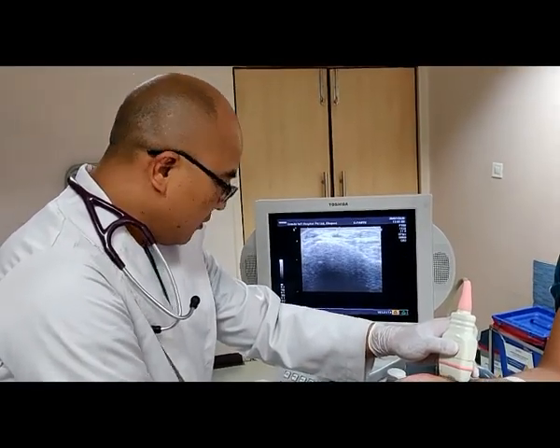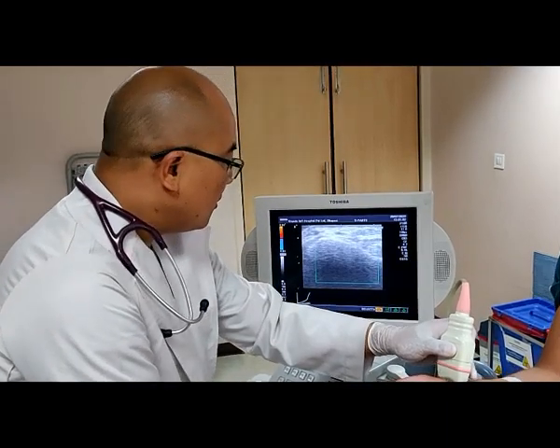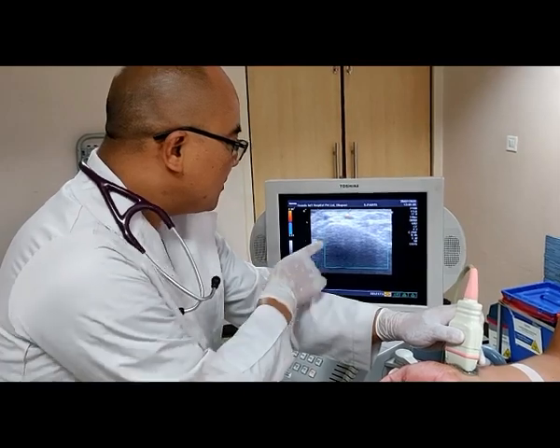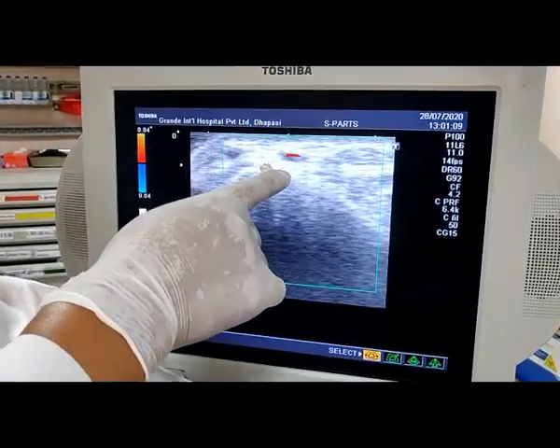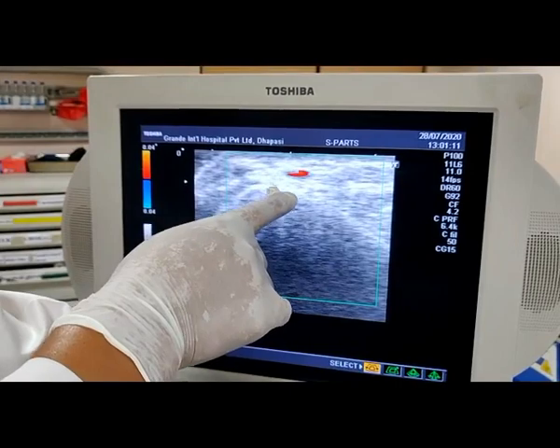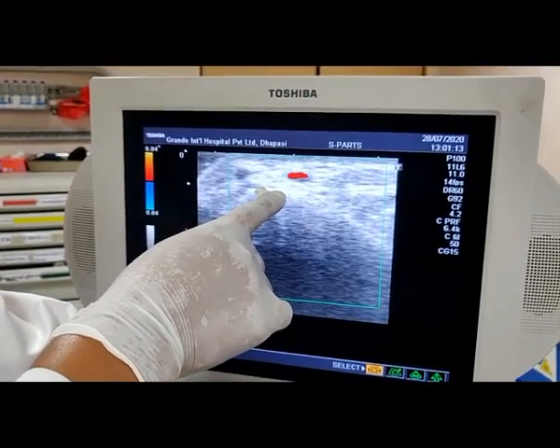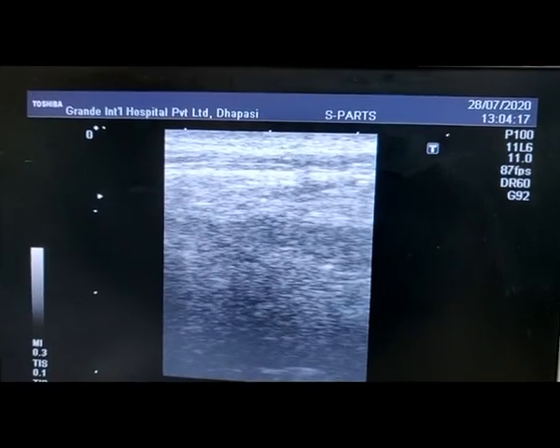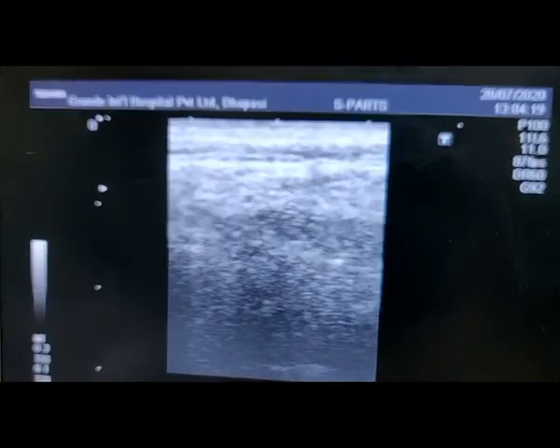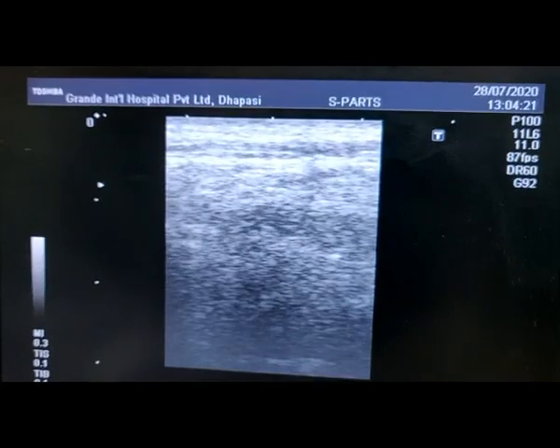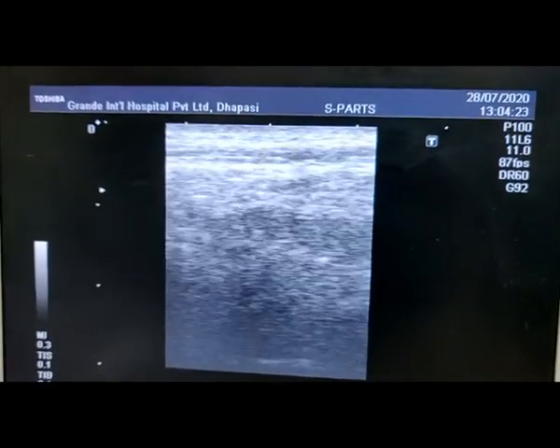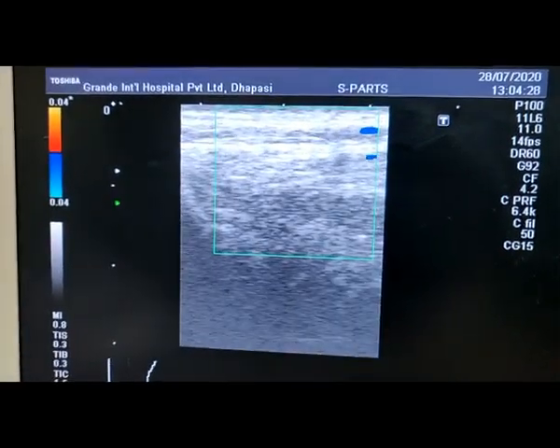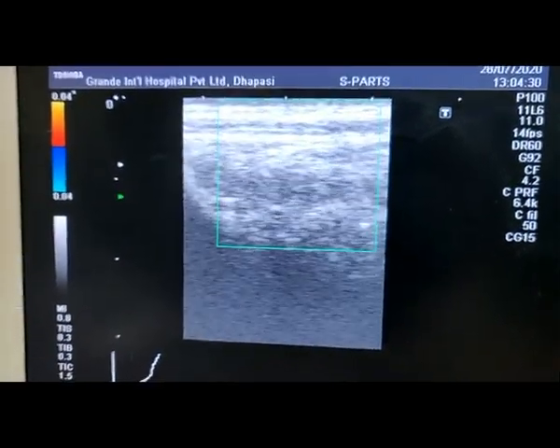If you have any confusion, we can put on the color Doppler. You can see that there is a pulsatile radial artery superficially. We can also put the Doppler on top of that to confirm there is flow in the radial artery.